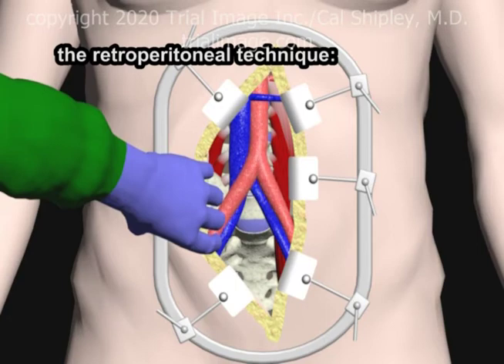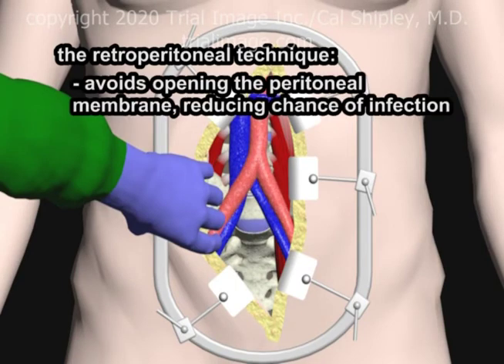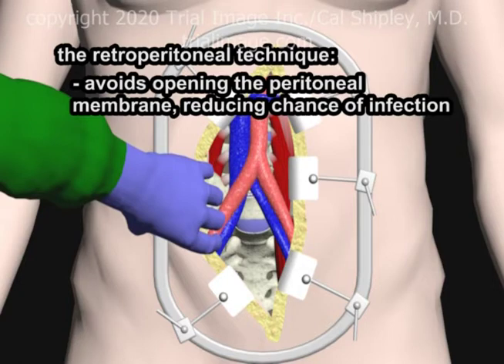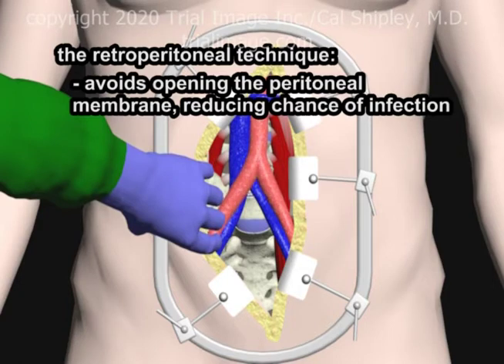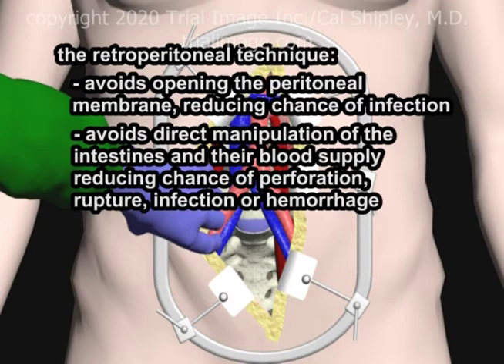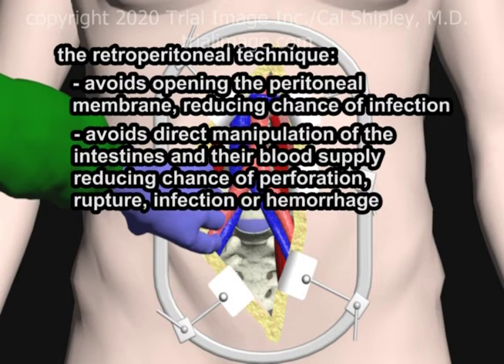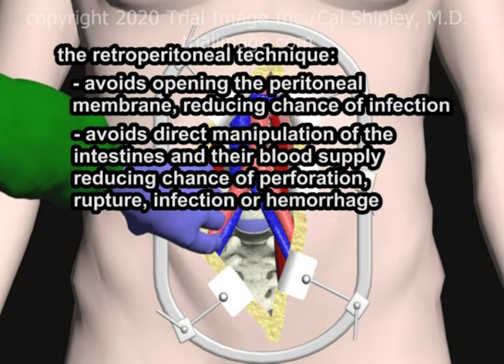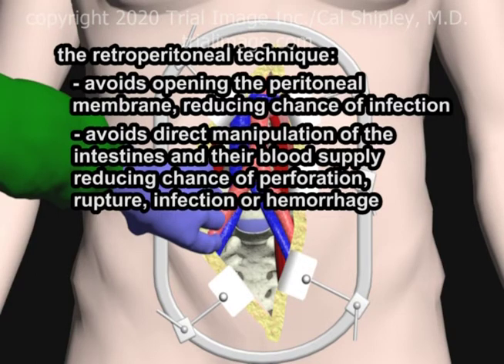This retroperitoneal approach avoids cutting or entering the peritoneal membrane and significantly reduces the risks of a postoperative abdominal infection. The retroperitoneal technique also avoids direct manipulation of the intestines and their blood supply, reducing the chance of perforation, rupture, infection, or hemorrhage.